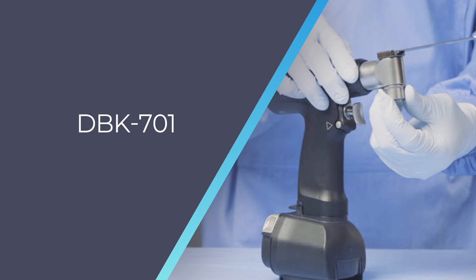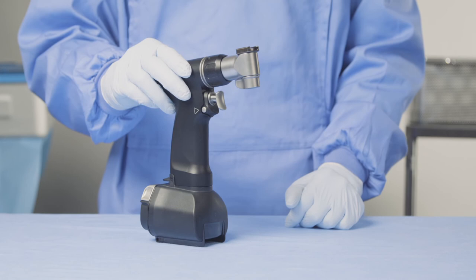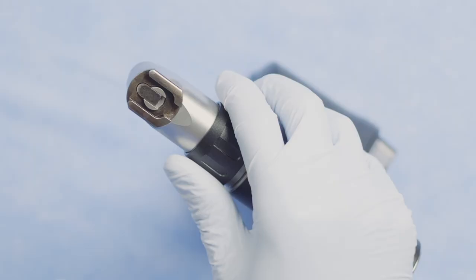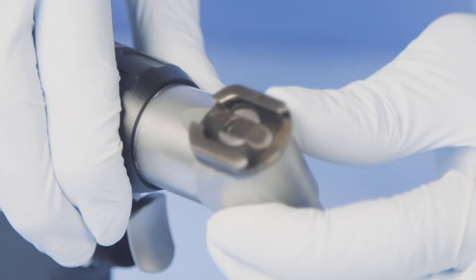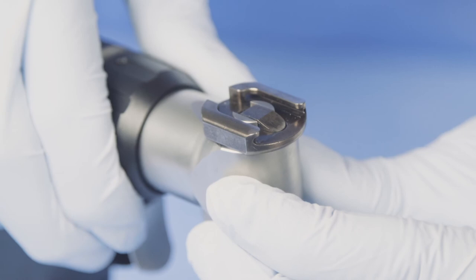Let's take a look at our DBK 701 dedicated sagittal saw. This sagittal saw is compatible with our S89 blade range. Before we go on to attaching the blade, I'm just going to show you how to rotate the sagittal saw head. You can do this by simply pulling back on this collar and locking it into place by turning it anti-clockwise. You then have free rotation of the sagittal saw head. You can lock it at any position by simply releasing the collar back into place, like so.